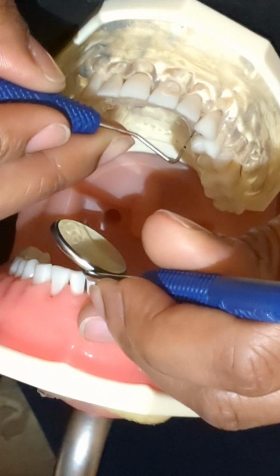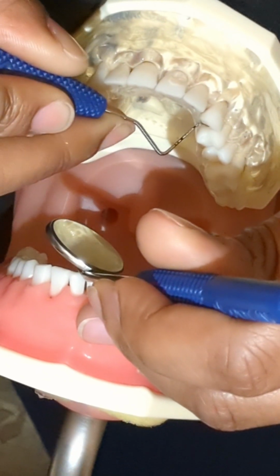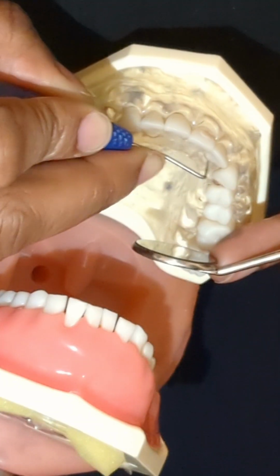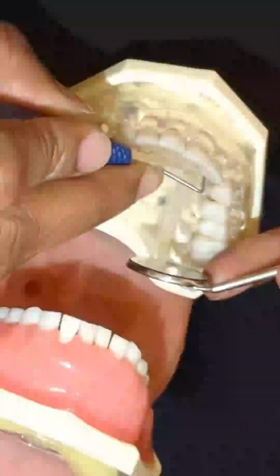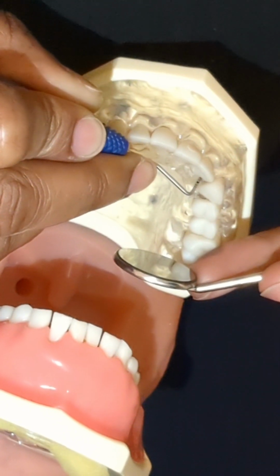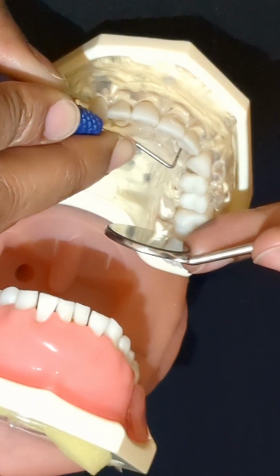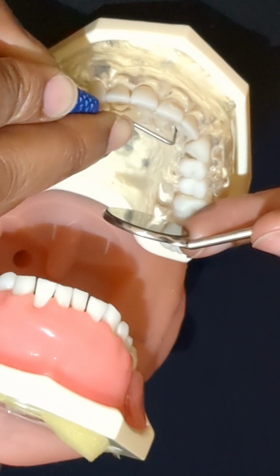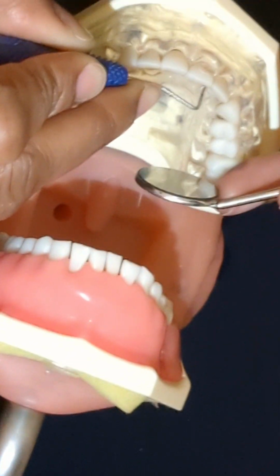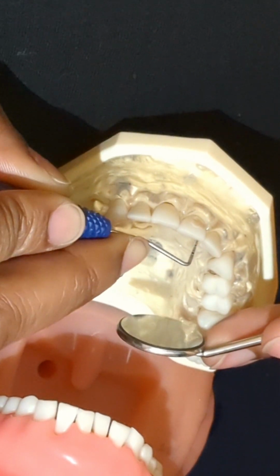Okay, so canine going distally. That is a 6. Nope, that is a 7. 6. That is a 7.